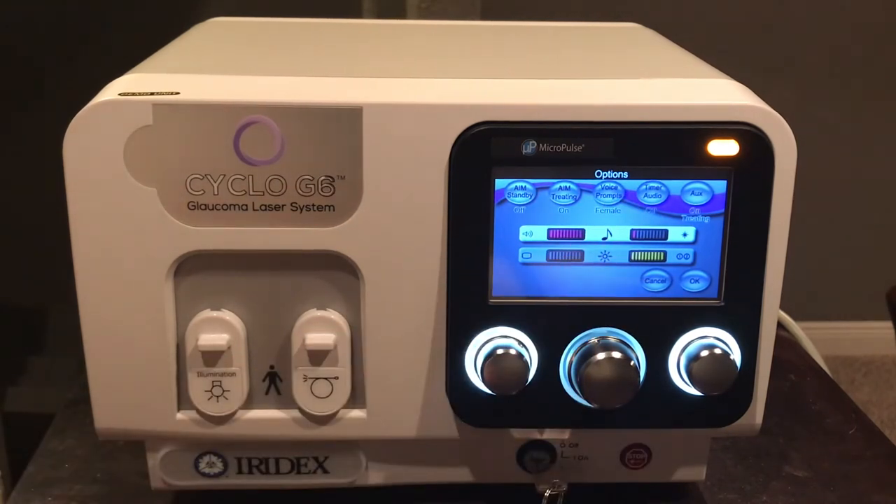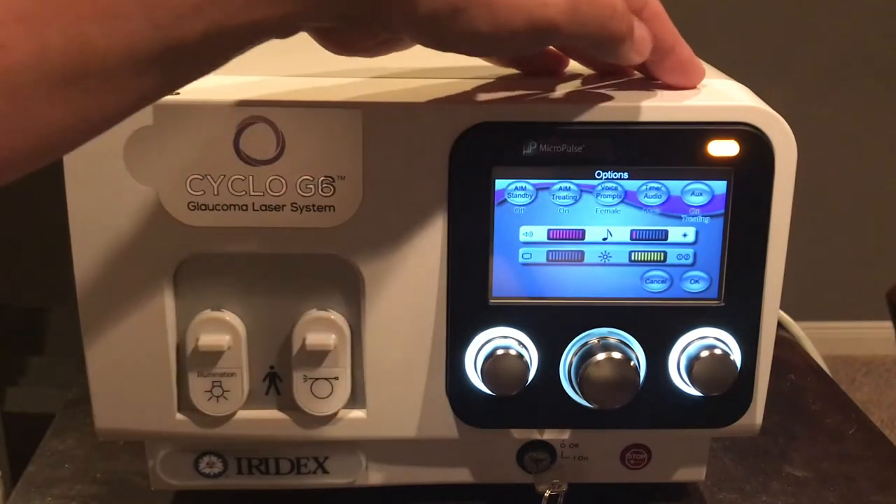There is a voiced prompt that counts down the duration every 10 seconds — you can choose a female or male voice. For example, starting at 80 seconds, it will call out 70 seconds, then 60, every 10 seconds. There is also a timer audio that ticks like a metronome every one second, so the surgeon can adjust cadence and sweeping speed accordingly.